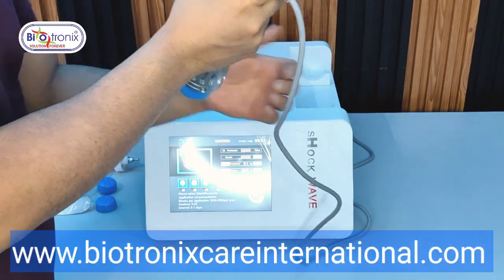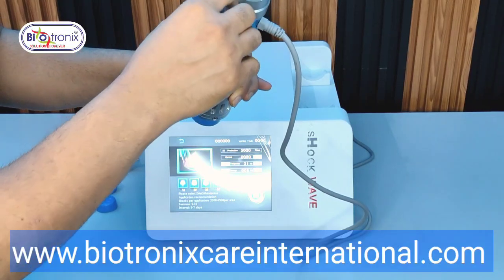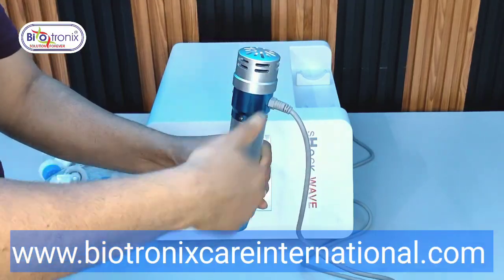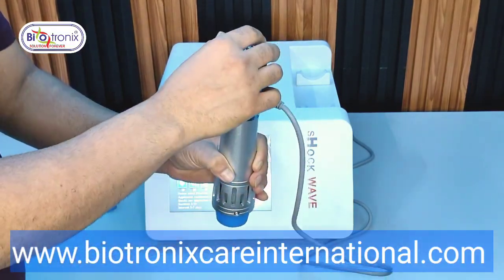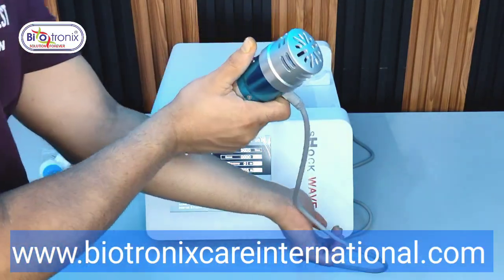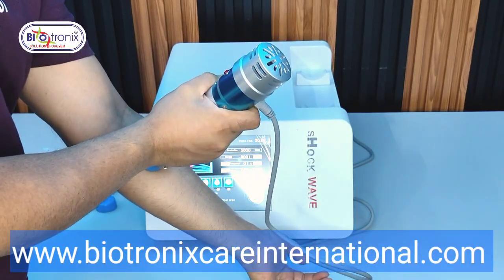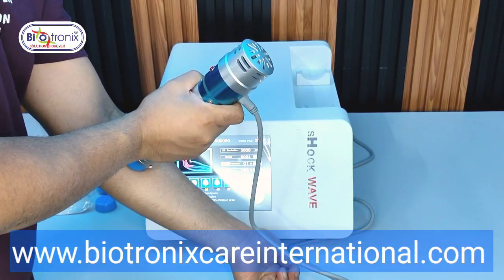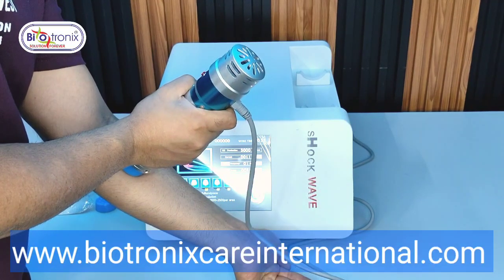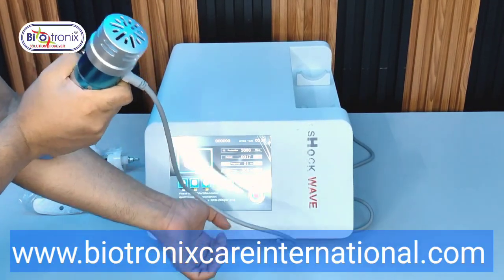I started the same. As soon as I click on it, you can see the sound of the fan. The fan is there in the probe to cool it off, because the bullet keeps on striking, so the handle will heat up. To cool it off, this fan is there. So now I'm putting the same on the joint, and as soon as I press that button, I will get the same. You can just zoom in. The frequency is 1 Hz and the energy is 5 millijoule, the starting ones.